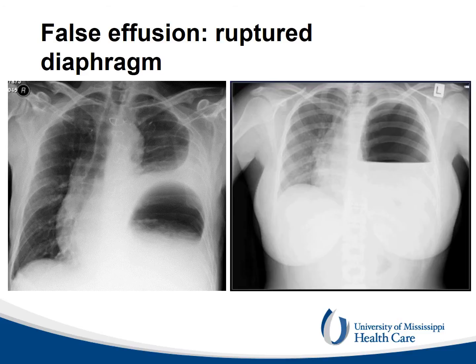As a consequence of trauma, the diaphragm may rupture, more commonly on the left side. The negative intrathoracic pressure favors the migration of viscera in the chest, creating opacity often confused with effusions. In the two chest X-rays presented, their fluid levels are intragastric.